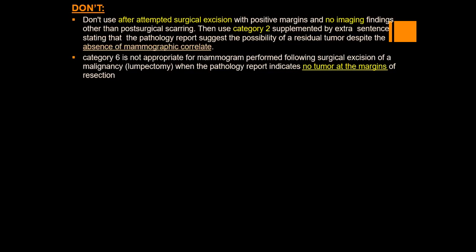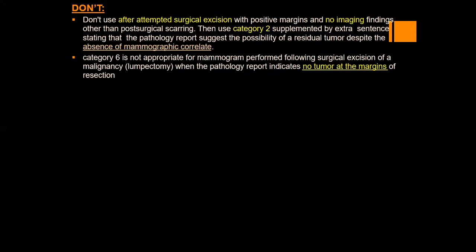Category 6 is not appropriate for a mammogram performed following surgical excision of malignancy when the pathology result indicates no tumor at the margin. If the pathology result revealed clear margin and we have seen any findings on mammography, we should not report it as BI-RADS 6. Okay?